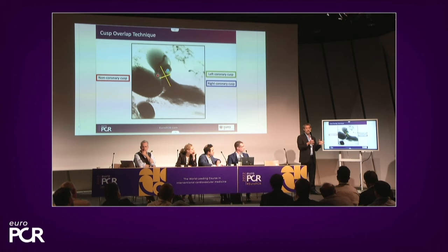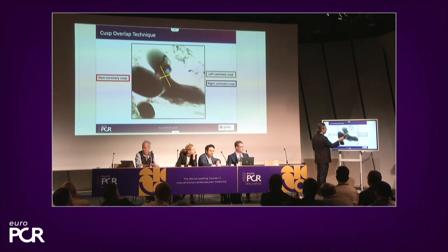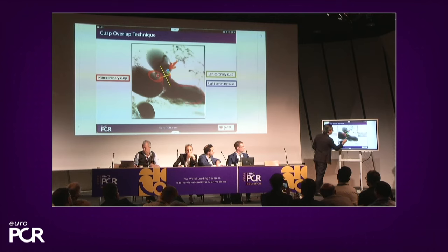And the double S curve, or I should say the cusp overlap, and I'll explain what the cusp overlap is in just a second, in about 90 to 95% of cases closely matches the double S. And that double S, like we said, gets your delivery catheter in plane and your annulus in plane. So if you do the cusp overlap and you advance your delivery catheter and your delivery catheter looks perfectly in plane, you've got the perfect position. Now, the cusp overlap technique, what we're actually doing is we're isolating the non-coronary cusp and we're overlapping the right and left cusp. And you can see here that we elongate the LVOT and we're in a three-chamber view.